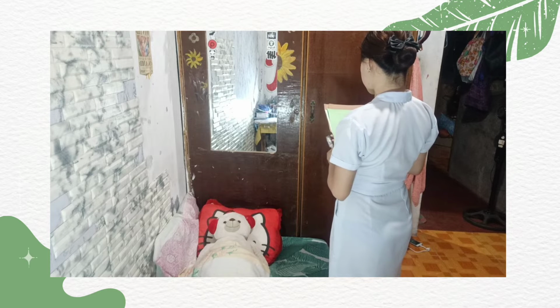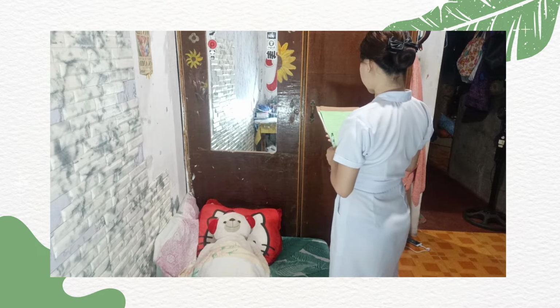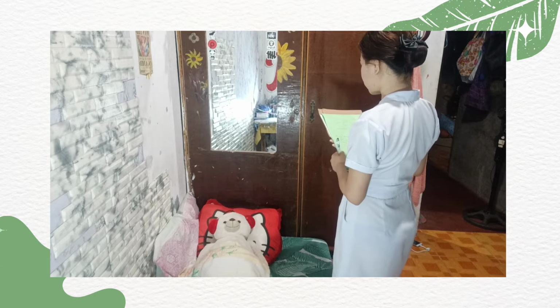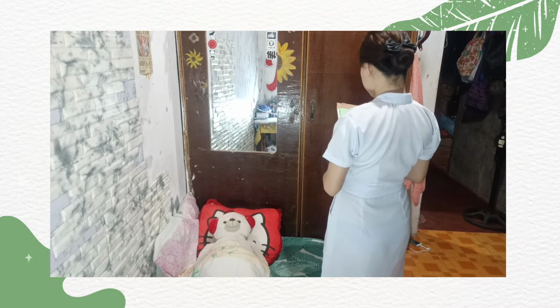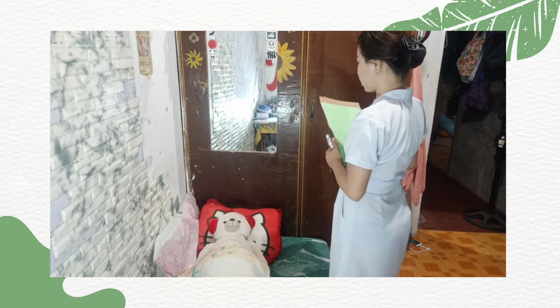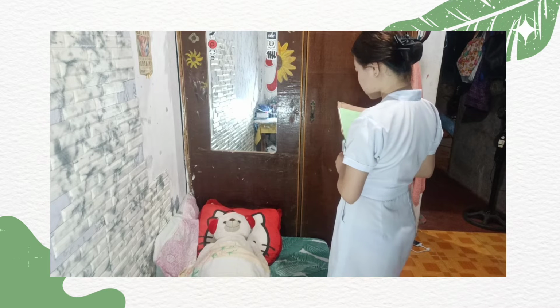This is based on the physician's order. This will help you to relieve your acute urinary retention. Ma'am, I am going to touch some parts of your body. Is that okay with you? Okay, ma'am. I am going to start the procedure.